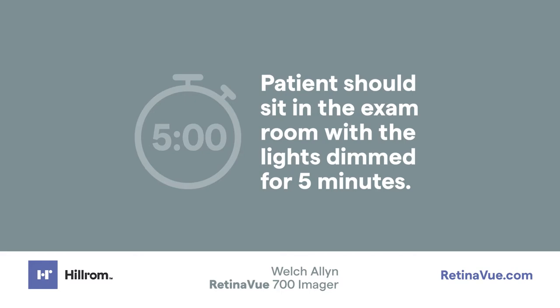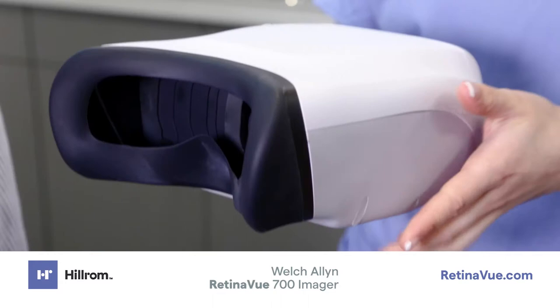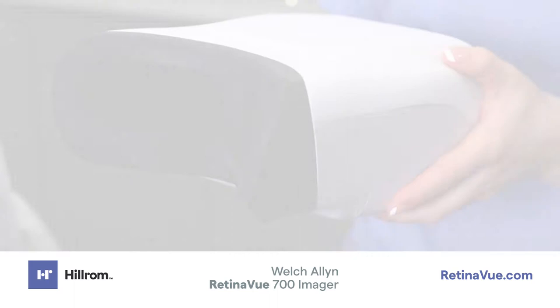Let them feel the face cup. The face cup is soft and flexible for maximum patient comfort. Patients should remove eyeglasses; however, contacts may remain in place.